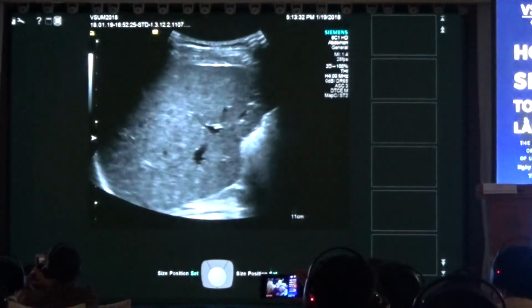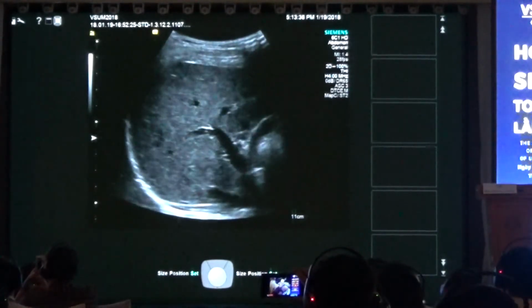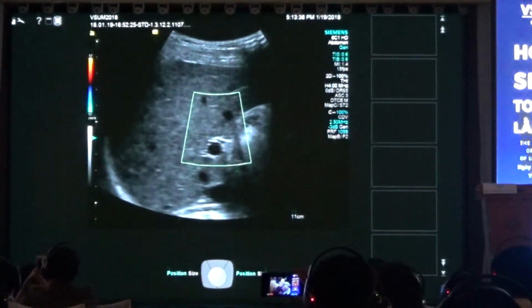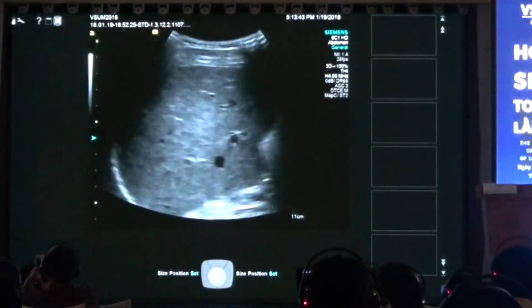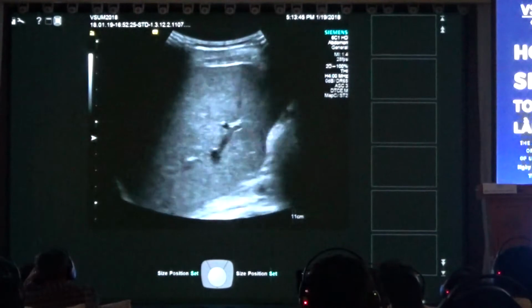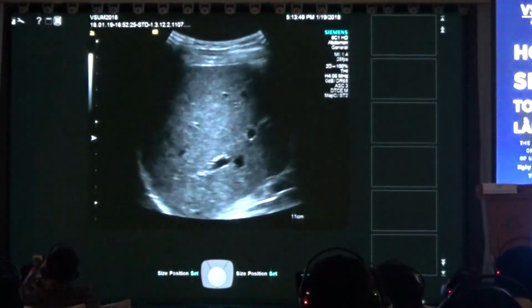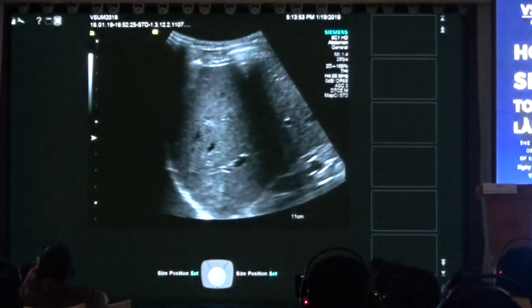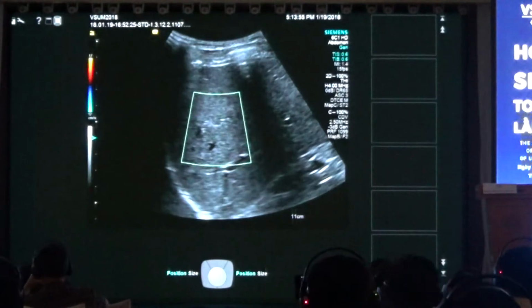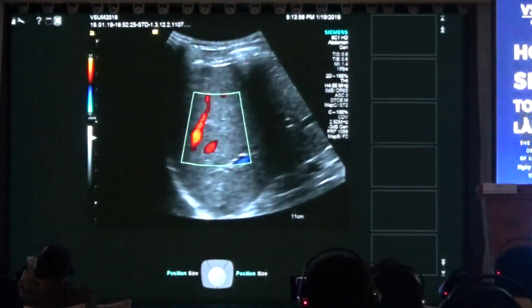In this position, you might see a few things. So you will see the portal vein right in the center. Nice color. You see, take a little breath, stop. Take a breath, stop. Okay, you can nicely see the liver veins in the center of the screen.